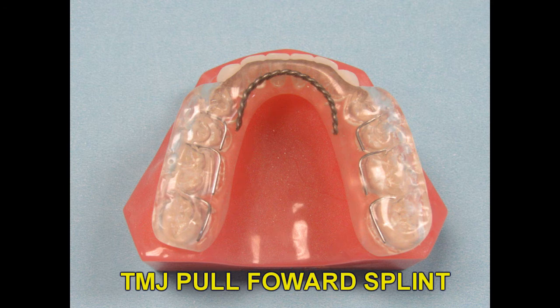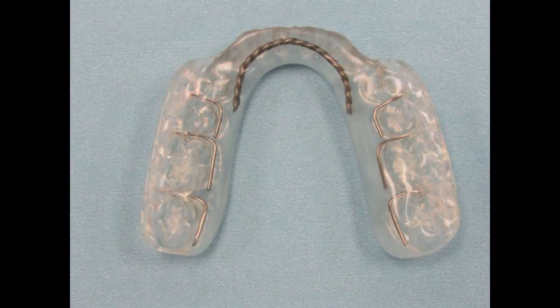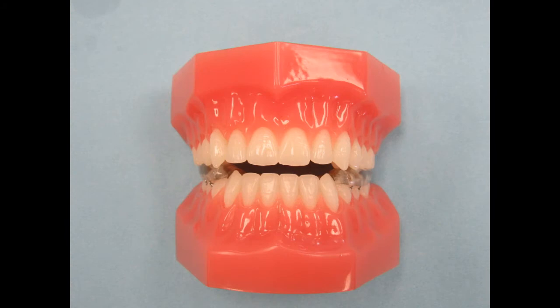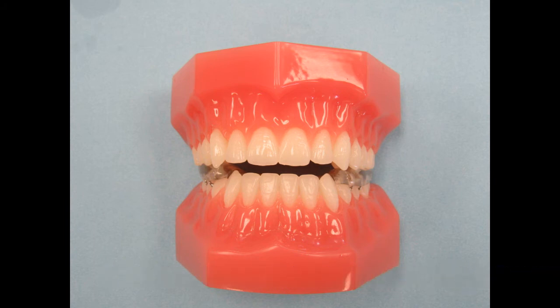A modification to the Gelb splint is the TMJ Pull Forward splint. This splint is very similar to the Gelb splint except there is an acrylic apron behind the anteriors instead of the Gelb bar. The lingual acrylic behind the anteriors will prevent them from super-erupting so the patient can wear this splint long-term. We will carry the lingual acrylic up to the incisal edge but not over it, which reduces the bulk of the acrylic so the patient can eat, speak, and function with it in place. The TMJ Pull Forward splint is made on the lower arch and should be worn 24 hours per day even when the patient eats. Deep indents of the upper arch will hold the mandible forward in the pain-free position. A good construction bite is very important so we can finish the occlusal surface to the correct vertical and AP position. We will discuss the bites later on in this video.